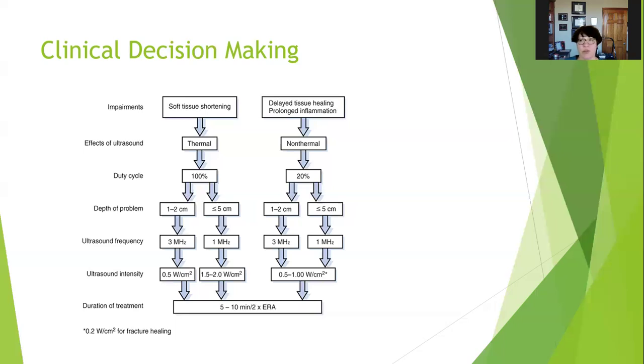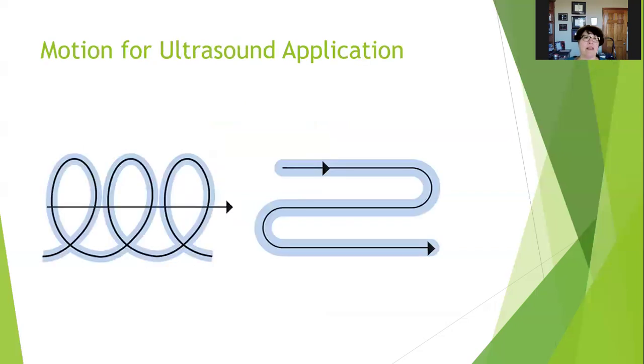Once you get used to them, if you're doing it fairly frequently, and I've got to tell you, I can't remember the last time I did an ultrasound, except in lab. I worked at a clinic where we didn't do them very frequently, for the last 15 years, and so this might be something that you keep just to look at, just to remind yourself of the parameters. But if you're doing it all the time, you usually remember that.